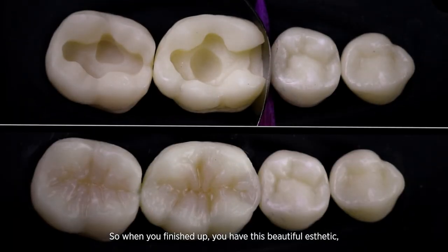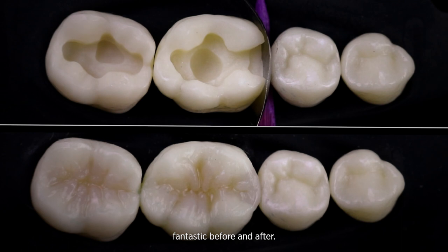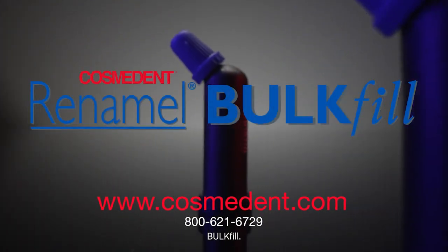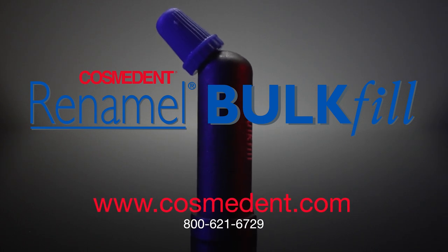When you've finished up, you have this beautiful aesthetic result. It's a fantastic before and after — a simple, effective, and easy bulk fill.